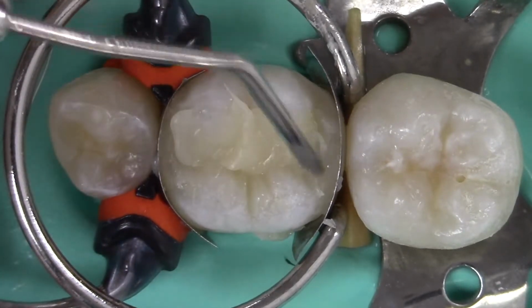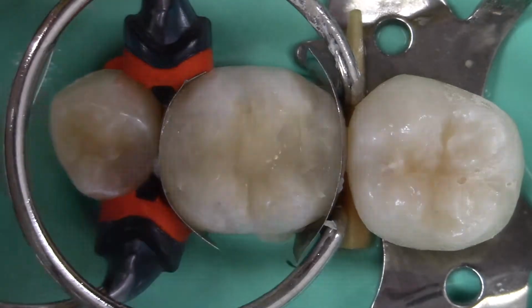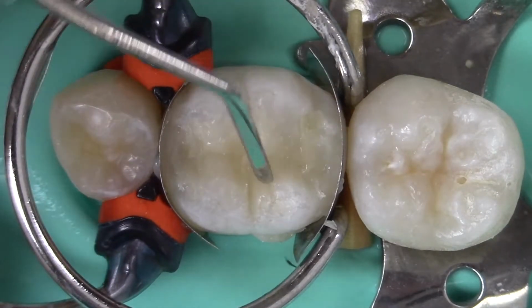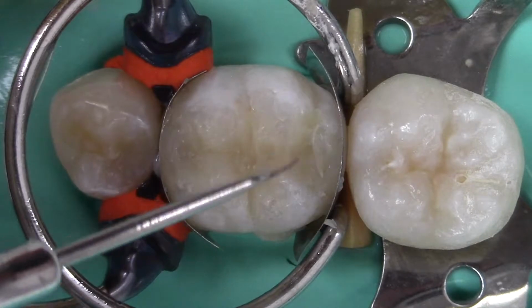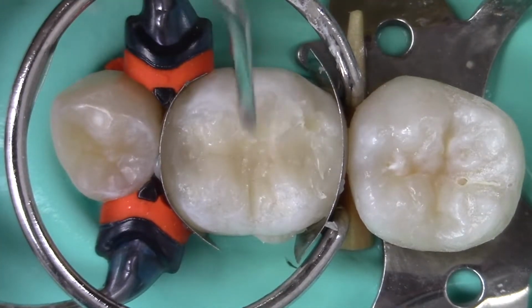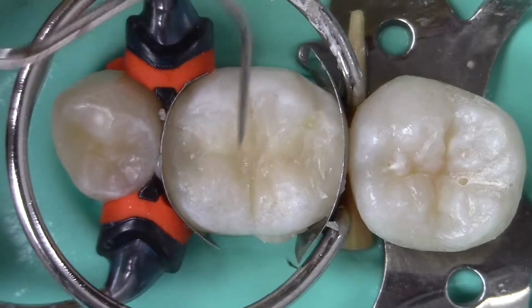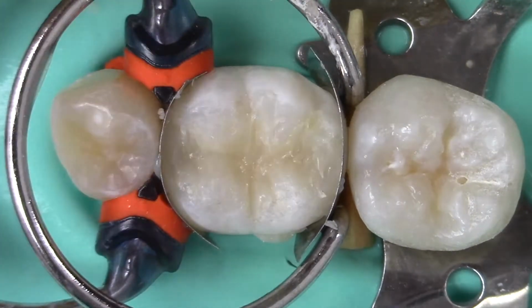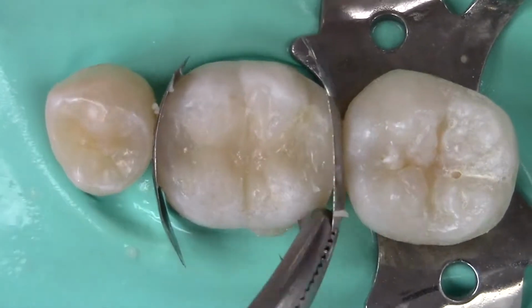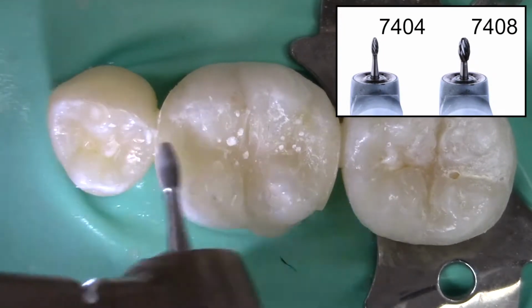This process is then repeated for the opposing cusp. Note, the material is constantly being condensed against the side of the preparation. Secondary anatomy may be produced with an explorer. The occlusal surface of the restoration is then finished with an egg-shaped red stripe finishing carbide.